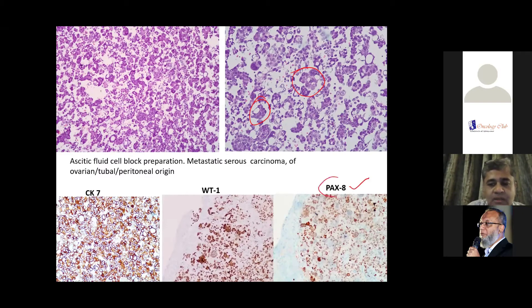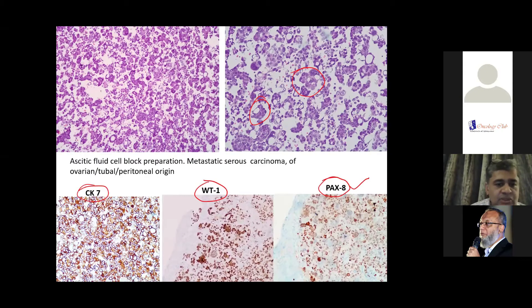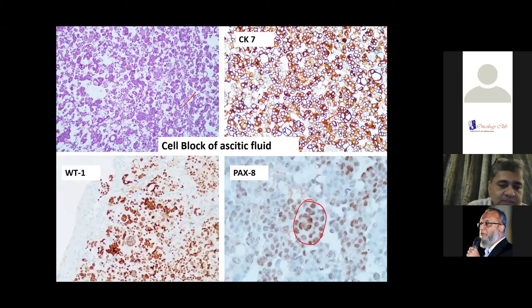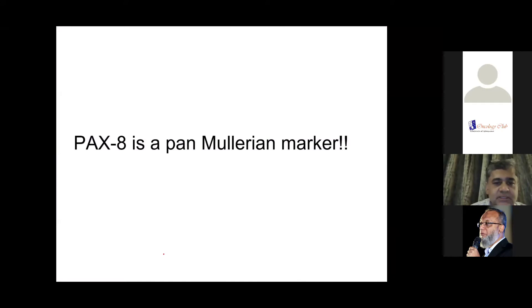In this case it is a serous carcinoma — PAX8 and WT1 will tell you it's a serous cancer. The picture shows a lot of tumor cells positive for CK7. PAX8 is a nuclear marker — it stains the nuclei. WT1 is also a nuclear marker, showing it's a serous cancer. PAX8 is a pan-Müllerian marker, so all clinicians should understand that when you see PAX8 in a report, it basically tells you it's possibly a Müllerian tumor.